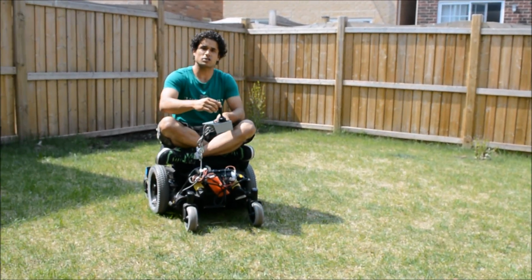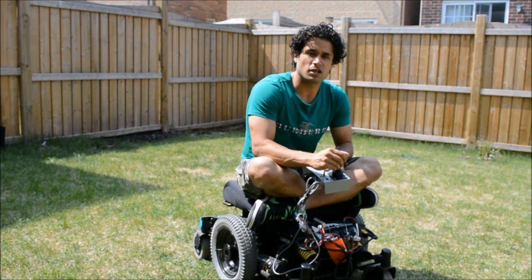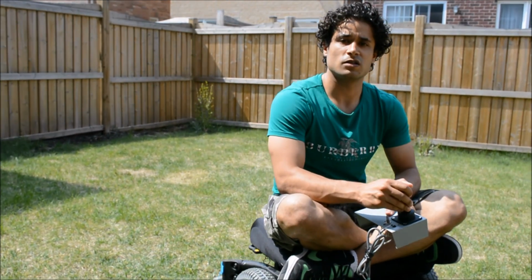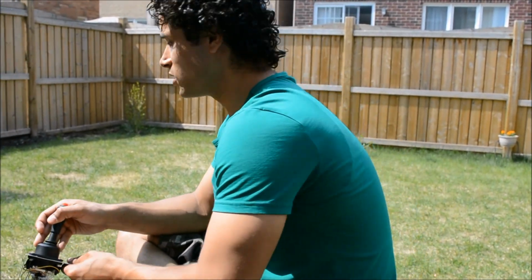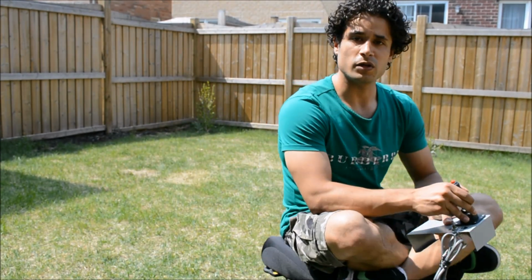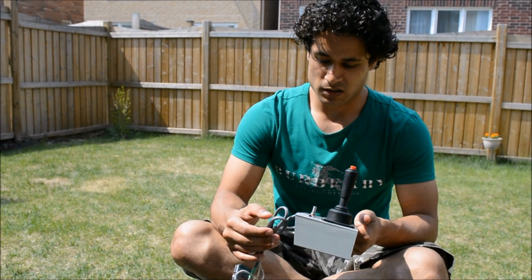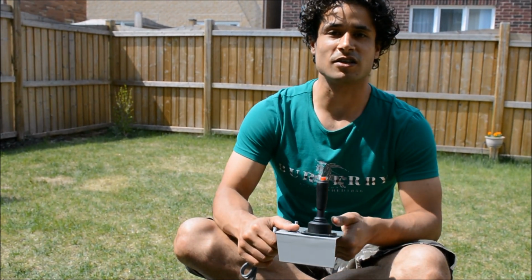Basically, all the same functions I can do through the joystick, I can also perform through the Bluetooth module as well. And that's basically the whole wheelchair control that I have done so far. And that's basically it.